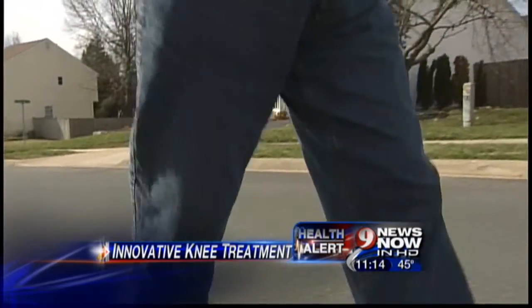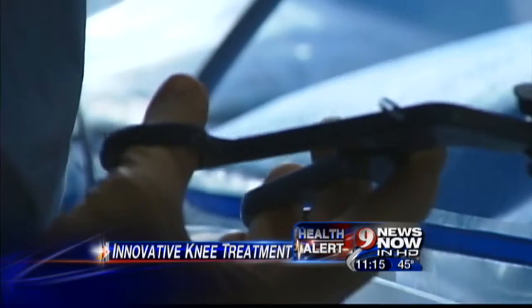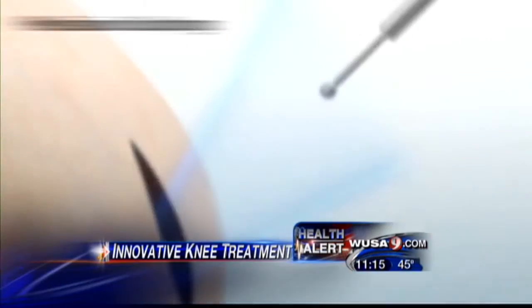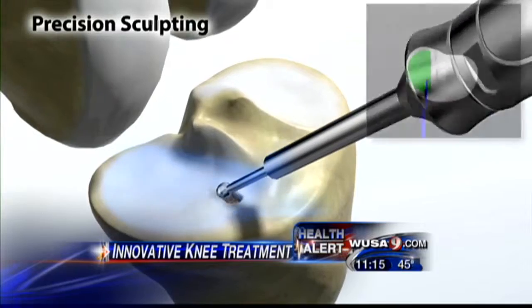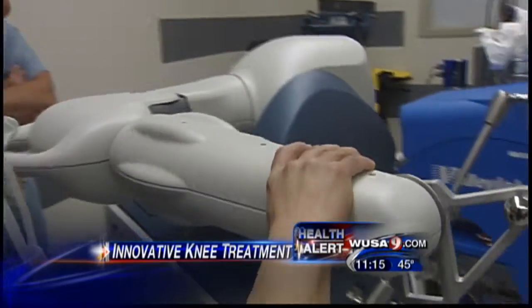He had physical therapy, cortisone shots, and other treatments, but it didn't alleviate the pain. The next step was surgery, and Danilo's doctor recommended a new, less invasive option called Makoplasty. It's a partial knee resurfacing, replacing the need for patients to have a total joint replacement when only part of the cartilage is worn away. Dr. Tony Aram can do that with the help of a surgical robot nicknamed Rio.